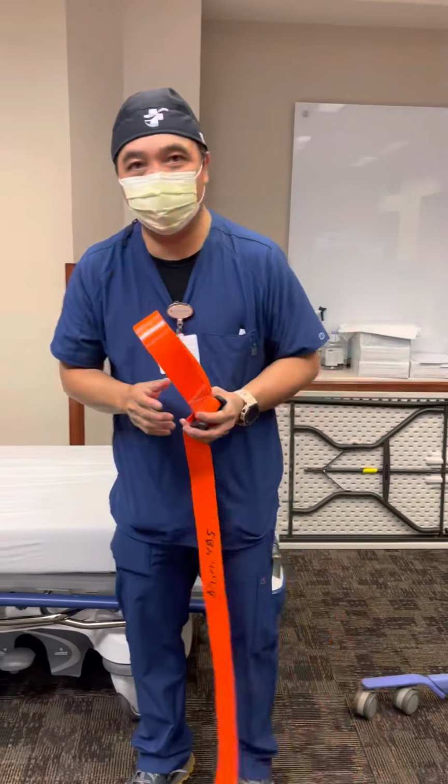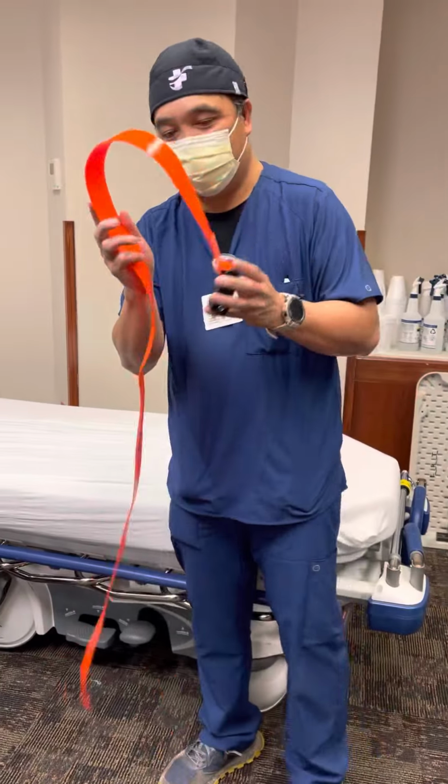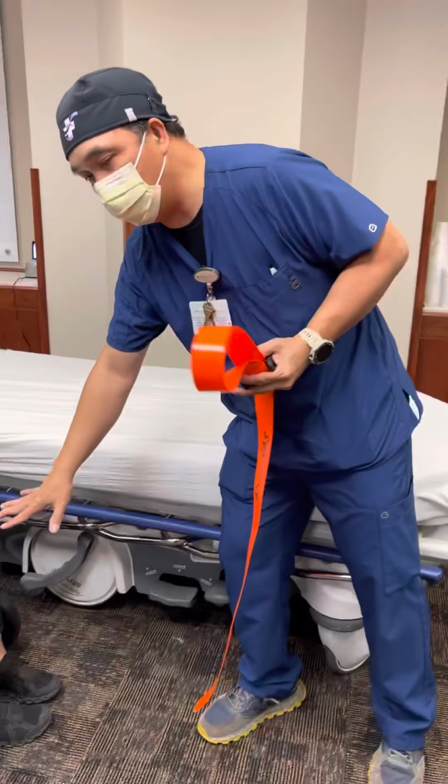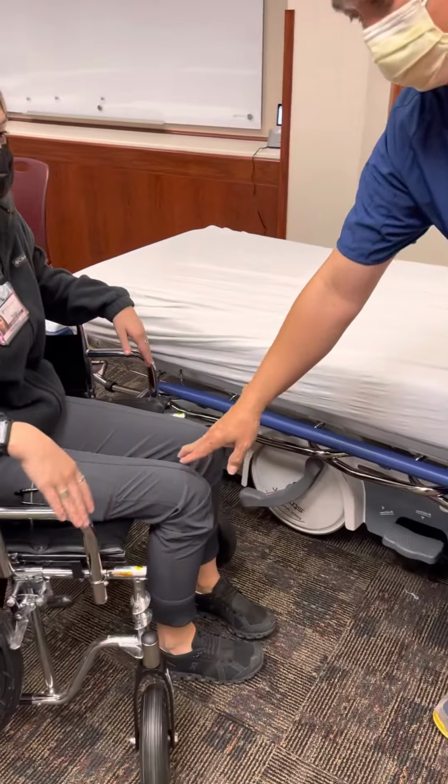I'm Roland, I'm one of the physical therapists here. I'm going to show you how to use the gait belt and how to transfer a patient. This patient has a non-weight bearing condition on this right leg, so she's not allowed to put weight on this right leg.